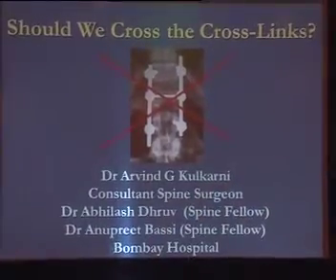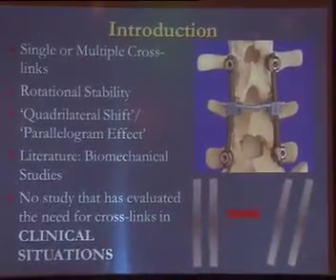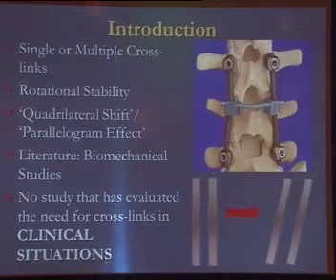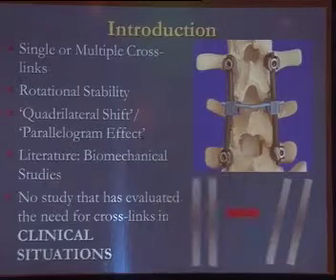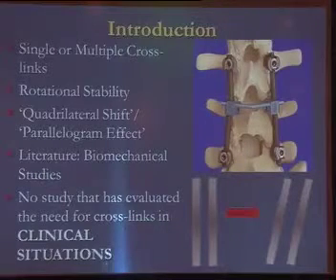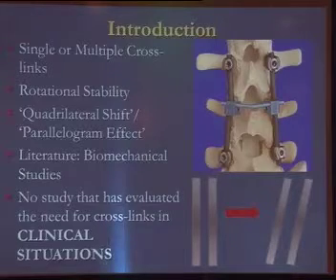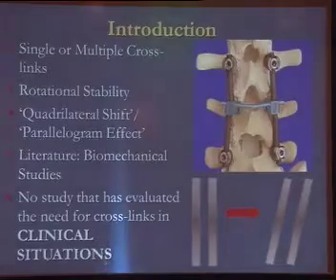This is an investigative paper. Crosslinks are something which we use routinely in our practice, single or in multiple ways. It is presumably supposed to provide rotational stability. Exclusion of crosslinks can possibly cause what is known as quadrilateral shift or a parallelogram effect, as shown in the picture down here.